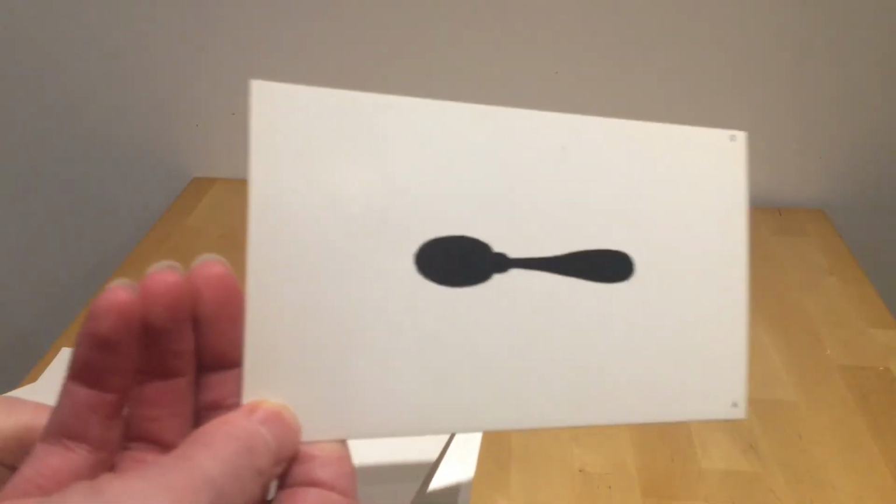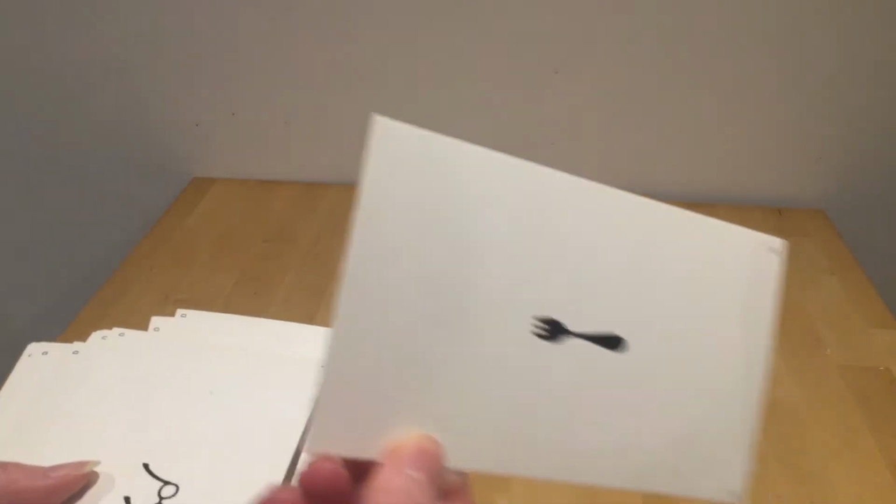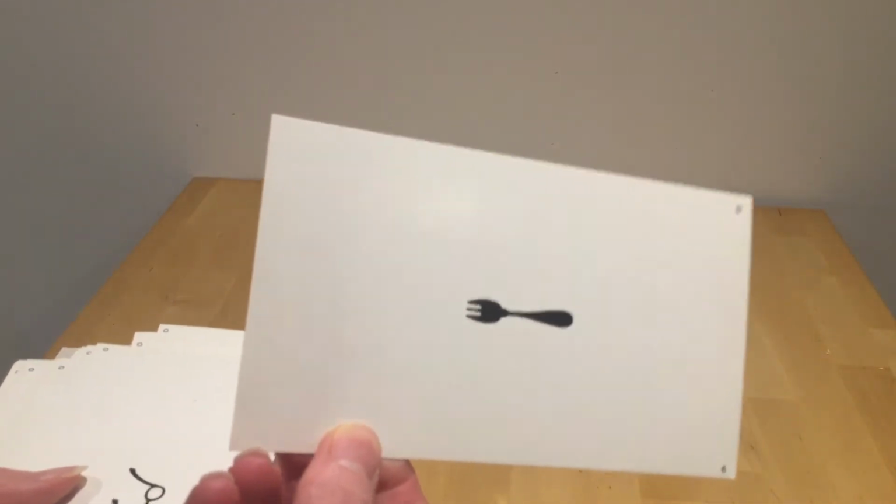So fork, scissors, glasses, and spoon. I'll just flip through just to show you that set 4 are spoon and scissors. And again, you're going to record when the child or young person makes an error. Here we have our fork at set 6.